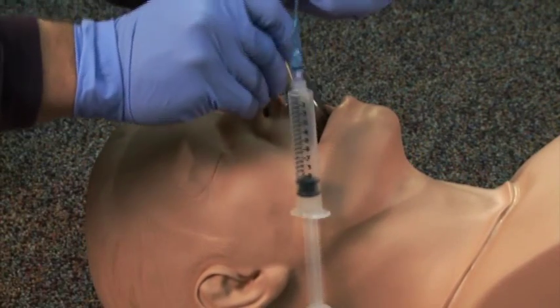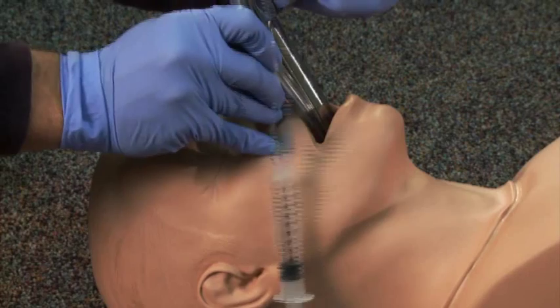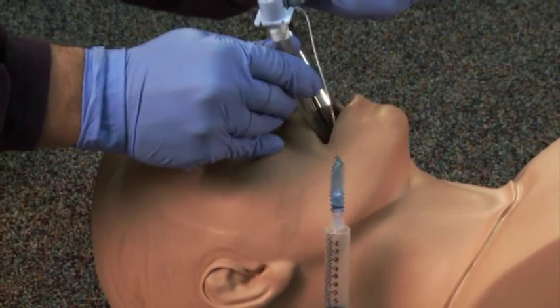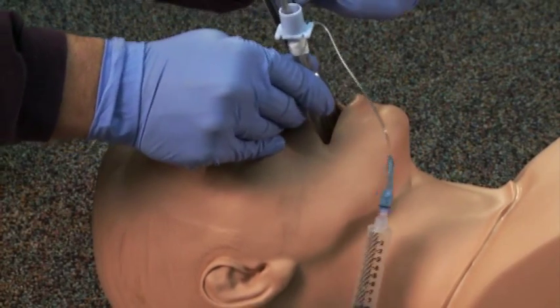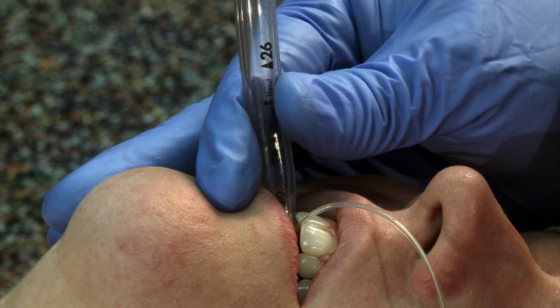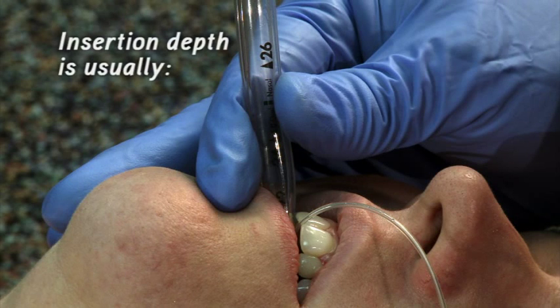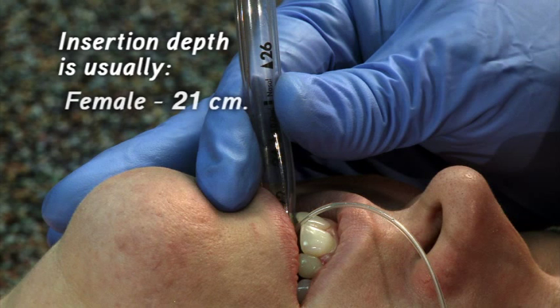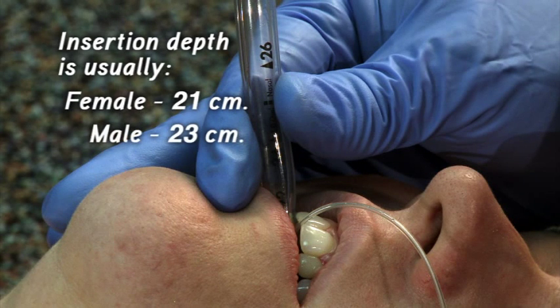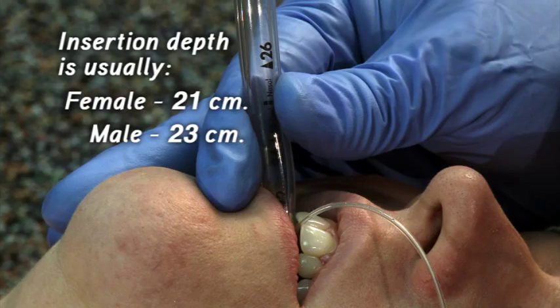With the right hand, insert the ET tube between the vocal cords until the proximal end of the cuff passes through the cords. Note the markings on the tube indicating the depth of insertion, which is usually 21 cm for the average adult female and 23 cm for the adult male.